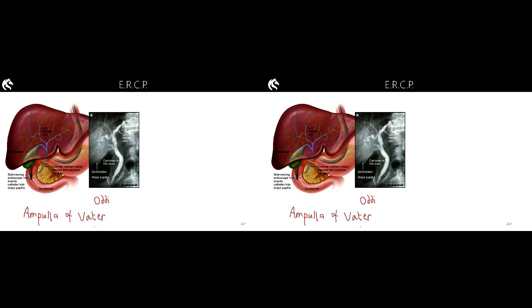It takes an incredibly skilled amount of use to be able to drive one of these things. Because once you've controlled this endoscope from a metre or so away, stopped outside the duodenum, you then have to thread a 1 or 2 millimetre catheter out the very end, or actually out the end of the side of the scope, and then feed it into this tiny little duct.